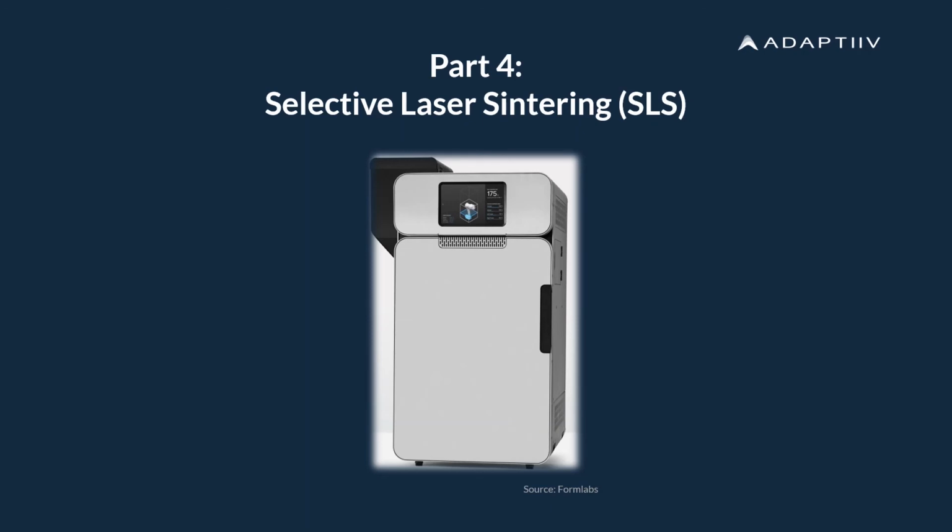The last technology that we will cover is SLS printing, or selective laser sintering. SLS is an additive manufacturing technique that uses a laser as the power source to sinter powdered material. In principle, this technology is different from the others as it uses powder material as its input.